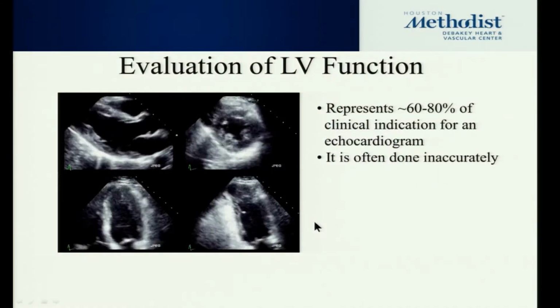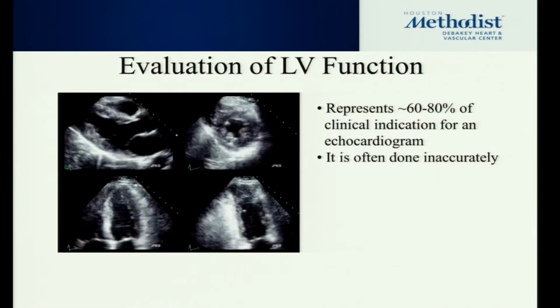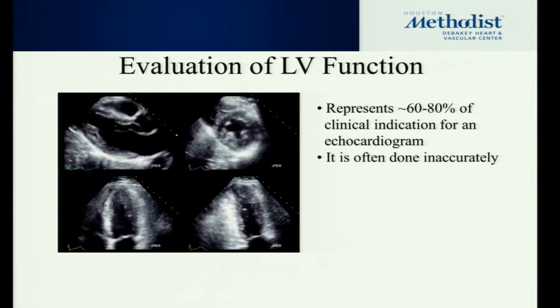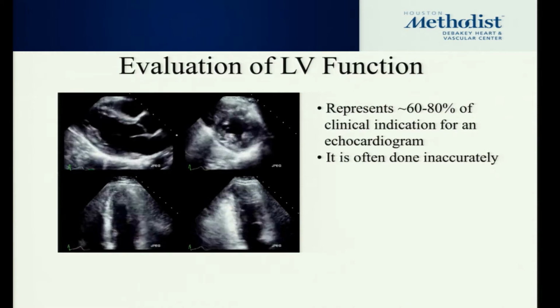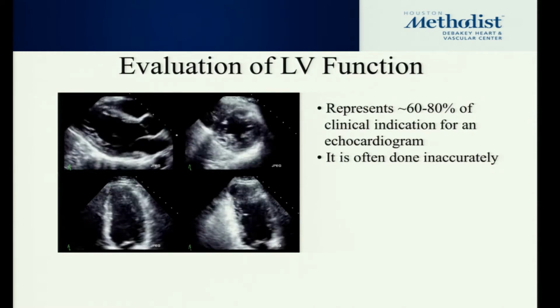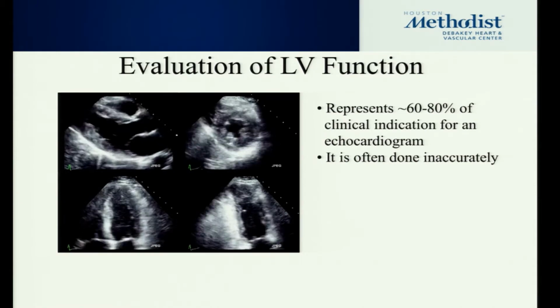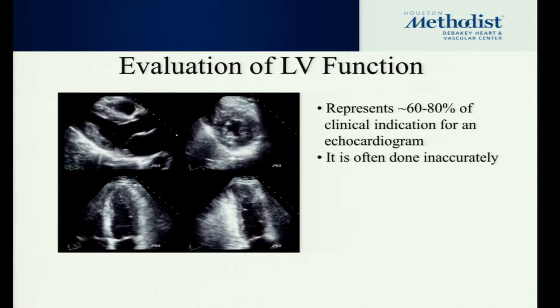Even today, on a daily basis, with our 100 plus echoes a day in the lab, at least 2/3 of those are being ordered because the physicians want to know something about left ventricular function. So it's still our number one request for an echo.